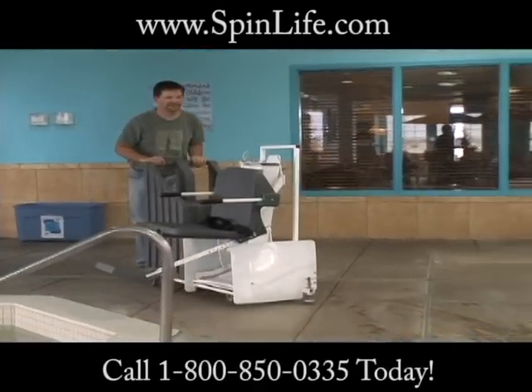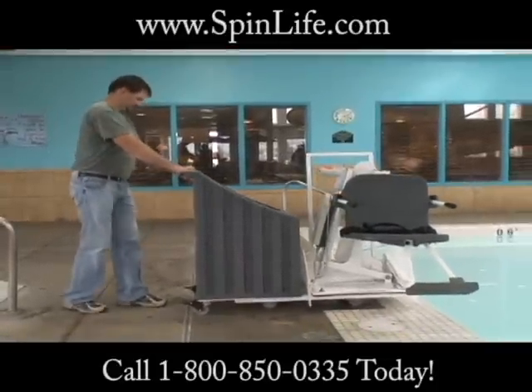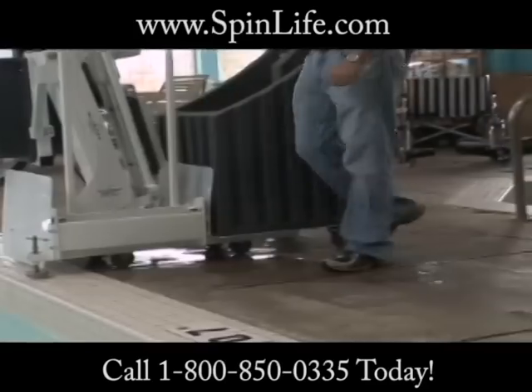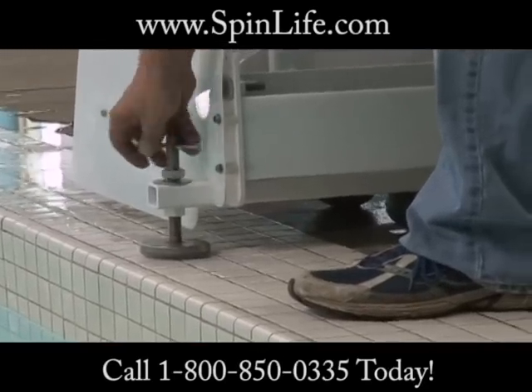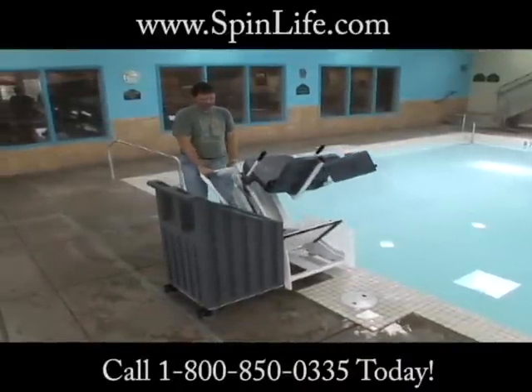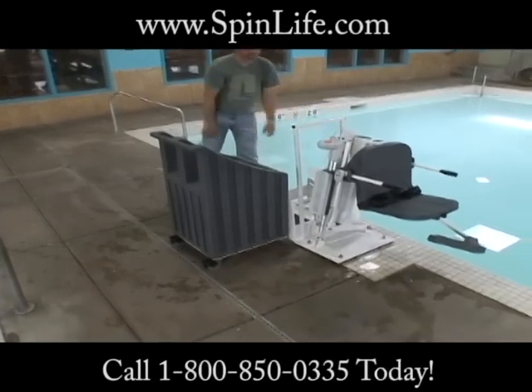Simply wheel the lift to the poolside. Lock the rear casters and screw the front pressure foot down so that it rests flush with the pool deck. Then tilt the lift back, slide it down the guides to the pool deck, and tilt forward. The lift is now ready to use.